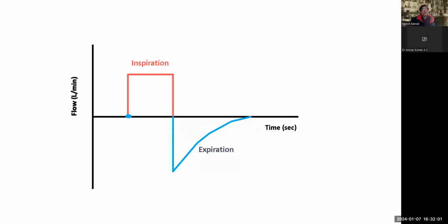So these are the main control variables within a breath. As you can see, there is an initial inspiratory phase, then the inspiration ends, then the patient goes to an expiratory phase. Then the gas flow reaches the baseline. So this is the basic respiratory cycle. There is an inspiratory cycle and an expiration. And in the first part, who triggers the inspiration? I've told. It can be either a patient triggered breath, especially when the patient is spontaneously breathing, or it can be a machine triggered breath.